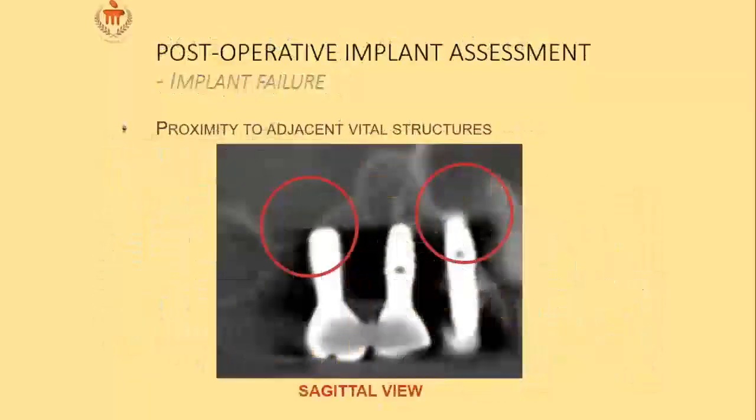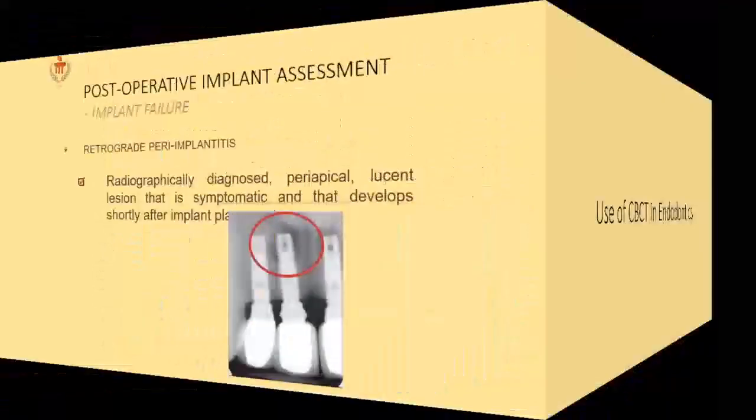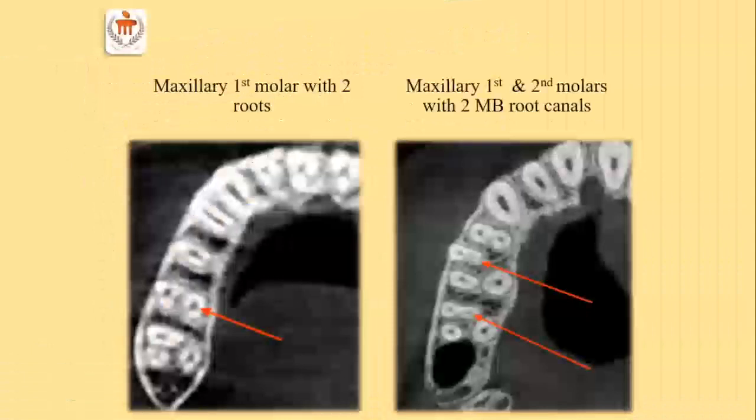Okay, so CBCT can also be used wonderfully well in endodontics, among other applications now. These funny things keep coming up. A lot of endodontists love to use CBCT because you begin to see these aberrations. Now you see a molar with two roots, the maxillary especially, so that's very surprising.